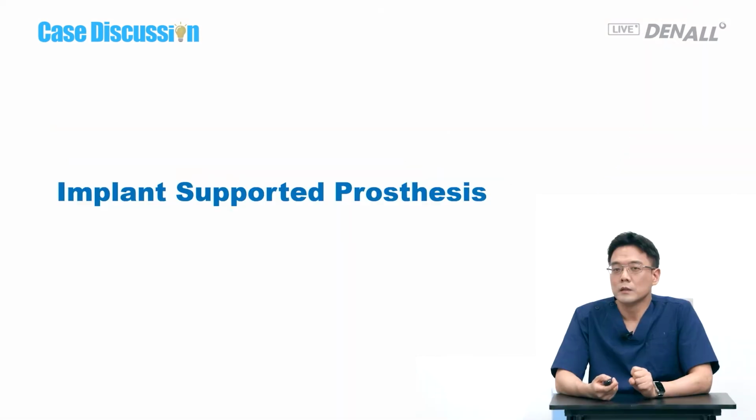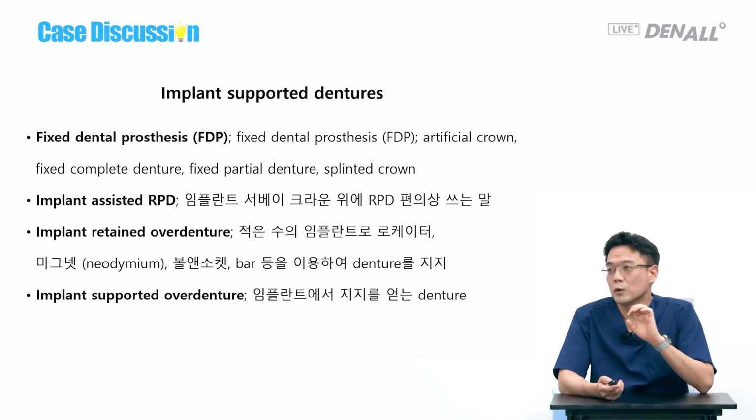Let me explain something first. Implant-supported prosthesis. I am working for the government, so I want to clarify the correct terms, whether I use the correct terms. There are terms used by prosthodontists or the general dentists. Fixed dental prosthesis. I read the case under discussion. She wants a fixed prosthesis.